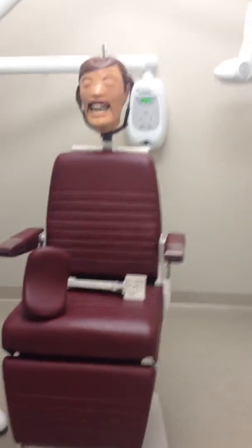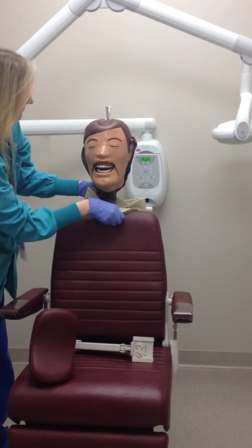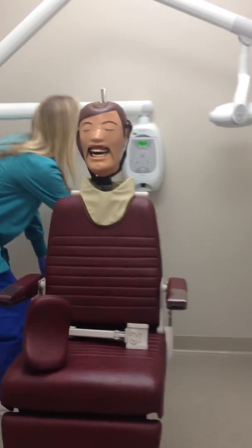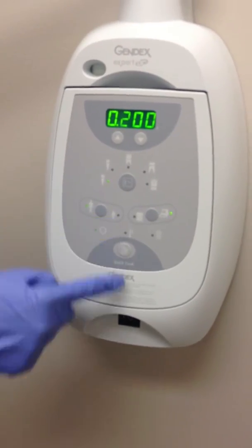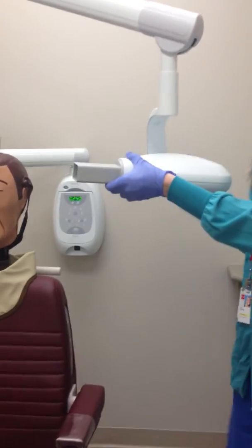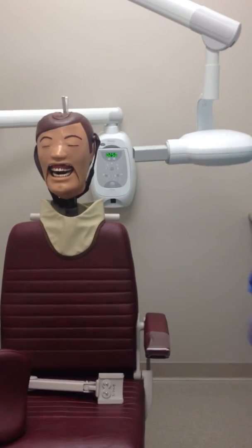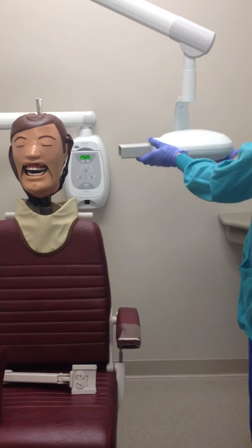Enter the room and place the thyroid collar on your patient. Make sure that the X-ray unit is on and switch to the adult or child setting depending on the patient. Switch the control to premolar on the PID arm. After you have adjusted your settings, position the PID close to the patient so you can be ready to take the radiograph. Make sure the headrest supports the head before aligning the PID with the ring to prevent movement while taking the radiograph. Adjust the chair to a comfortable height for the operator.